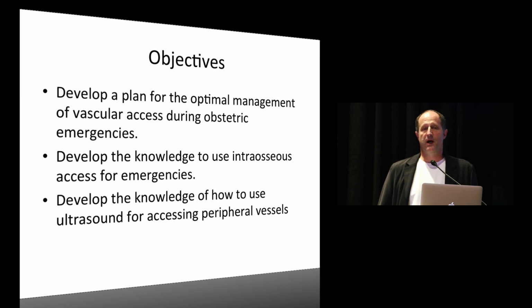whether it be for large bore IV access or just really rapid access in an emergency situation. I can tell you that even just last week we had a woman coming in for a cesarean hysterectomy, and we looked at her arms, and there were absolutely no visible veins. We used the ultrasound to start a large bore IV on the first try, and we had adequate access for the case. It wasn't an emergency situation, but it's nice to be able to place access real quickly and not be delayed. We found that very advantageous.